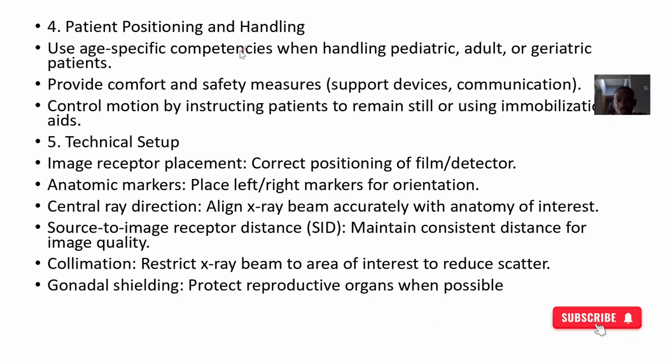Patient positioning and handling: you use age-specific competencies. You provide comfort and safety measures. Then you control motion by instructing the patient to remain still and by using immobilization aids.